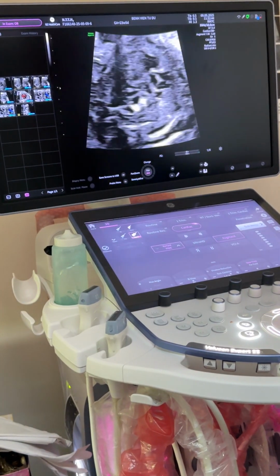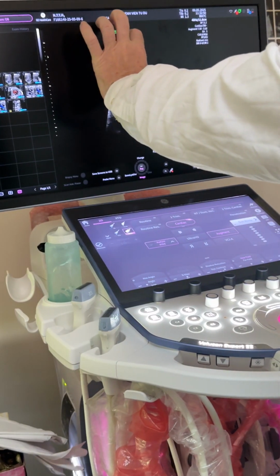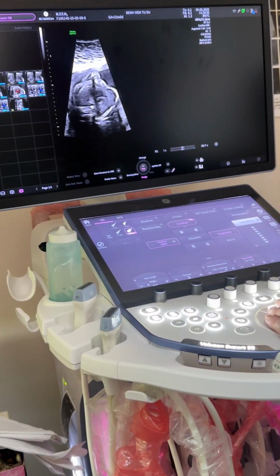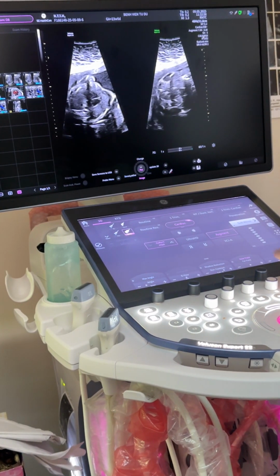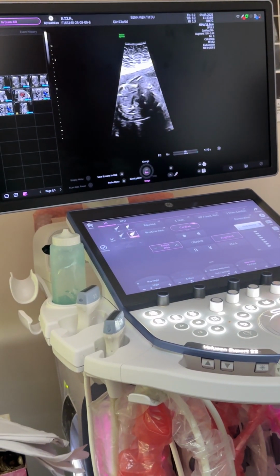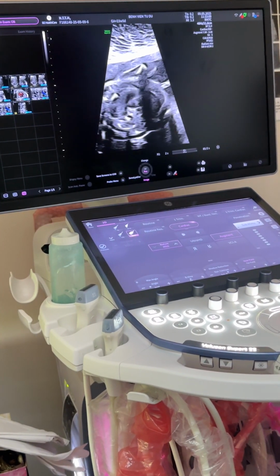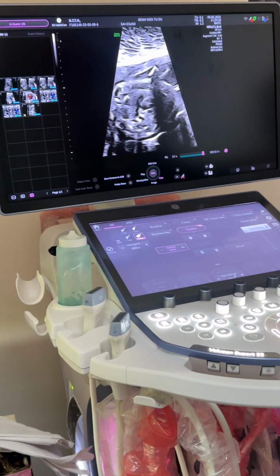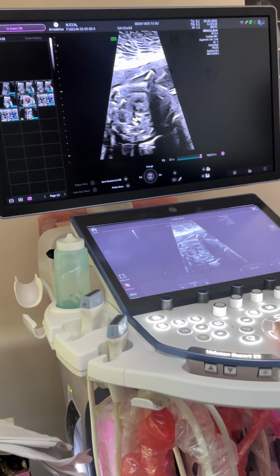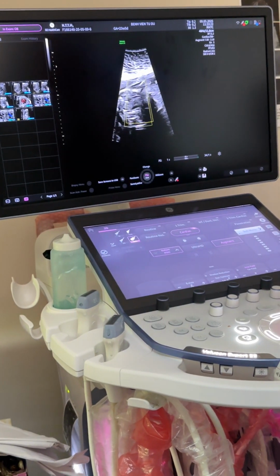With regard to seeing an aberrant subclavian artery, this is hard at this stage, 23 weeks with a BMI. But to see it, this is the heart pointing towards the left-hand side, so that's the heart on the left. The aberrant subclavian is going to come off in this direction here. Now, at 23 weeks of gestation, sometimes you can see these by looking just with 2D, because if you look at this vessel here, this here is the trachea, and you can see in 2D that there's something going behind the trachea. So that fits with a picture of an aberrant subclavian.